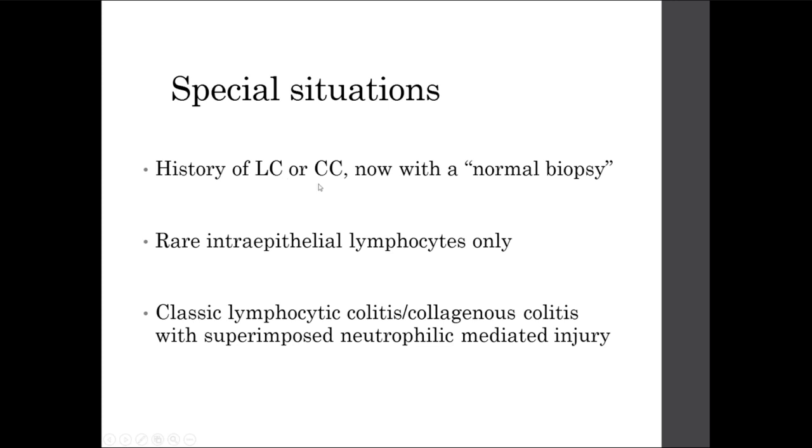So if the patient has a history of lymphocytic colitis or collagenous colitis and now comes with a normal biopsy, sometimes people wonder, should I call this normal in remission? We call this normal. Actually, if we're not seeing features of collagenous colitis now, I call it what it is, what I see, right? Intact colonic mucosa or colonic mucosa with no diagnostic alterations, whatever the terminology you like to use.